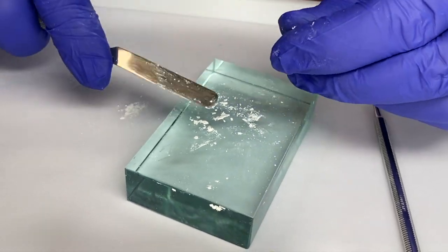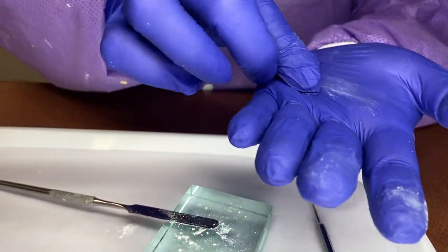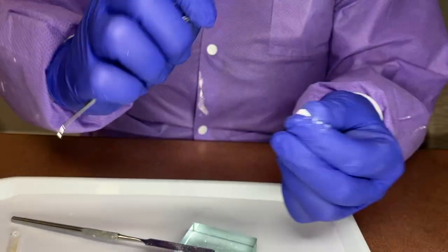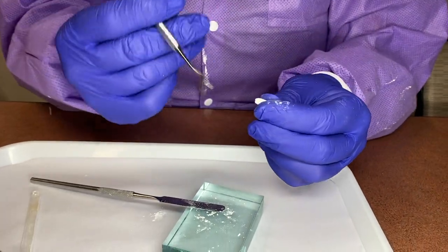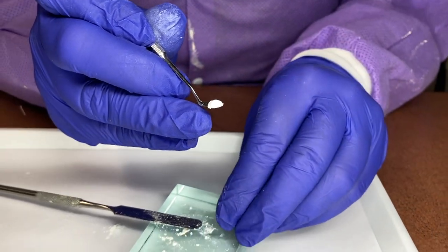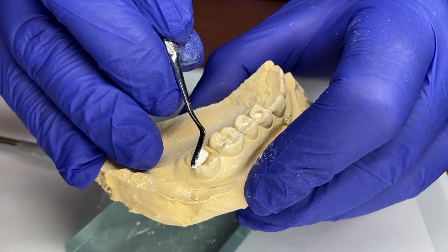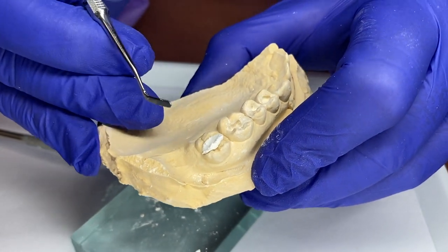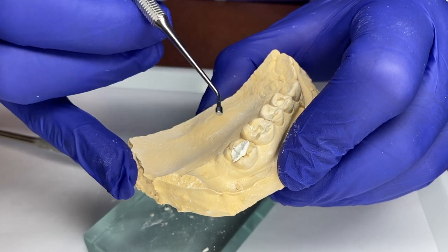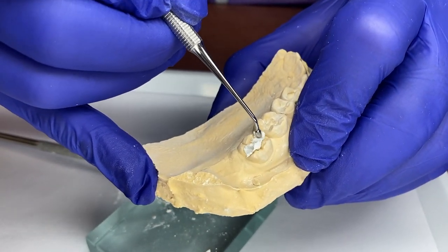Scoop it up. Roll it into a little ball. There we go. So we can take some of this, just cut a little half of that since our prep site's not that big, and we're going to put this in there, using the plastic end of the instrument. Then I'm going to take the condenser, use my fulcrum, and push, push, push, condense it in.